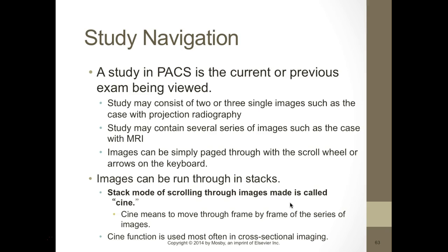Study navigation. A study in PACS is the current or previous exam being viewed. A study may consist of 2 or 3 single images, such as a case with projection radiography. A study may also contain several series of images, such as a case with MRI. We'll run 4 or 5 sequences for each study.